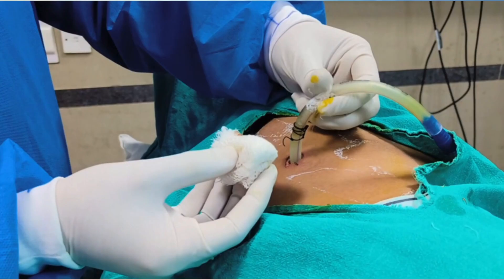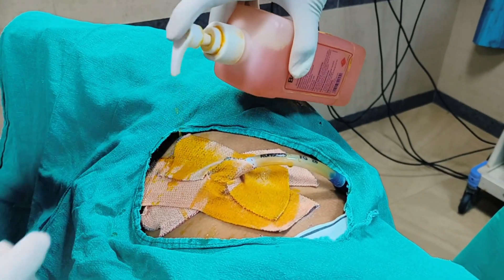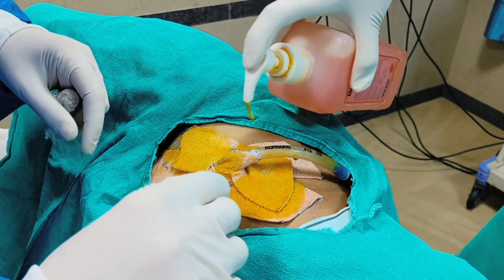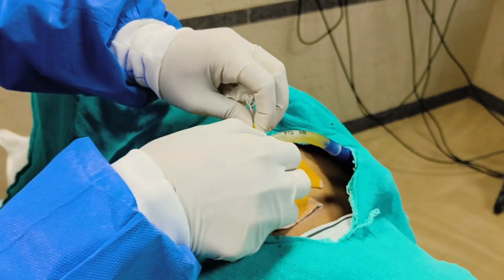Good morning friends. Today we will see the removal of ICD. We will pour Savlon or any other liquid to loosen the dressing, so the dressing will easily come out.